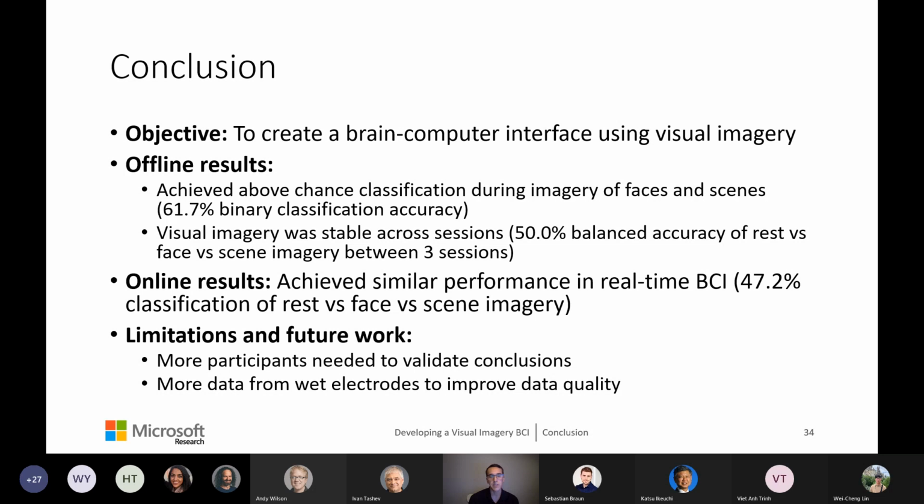So this balance measure helps to create a less biased classification score, where instead of just judging how many total it got right and how many total it got wrong, it finds the classification accuracy per category and then averages them together. It helped here because our classifier was actually pretty good at identifying the rest periods. So if we used just standard classification accuracy, it would have looked like a lot higher score than it actually was.